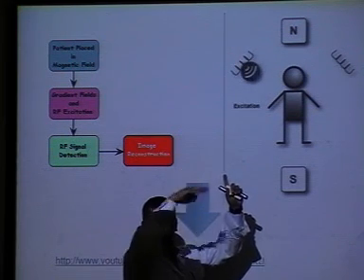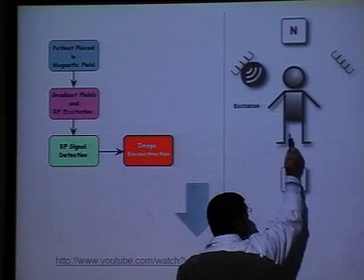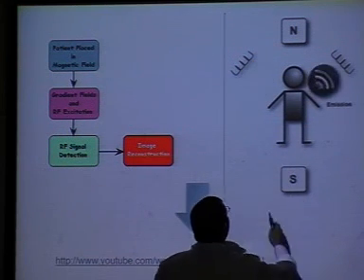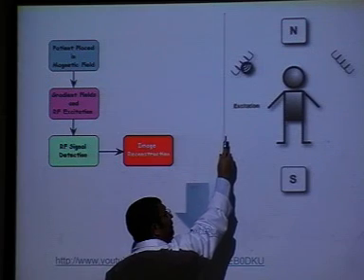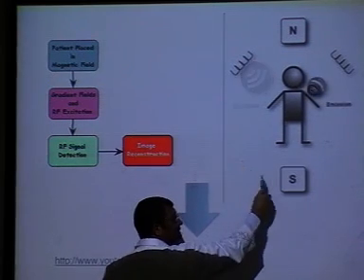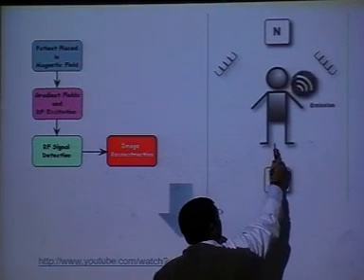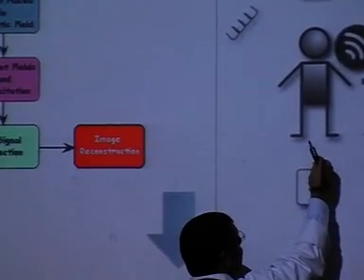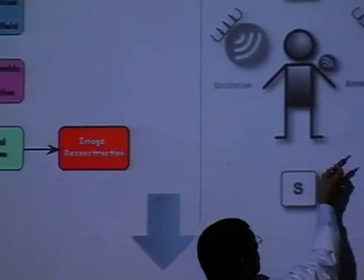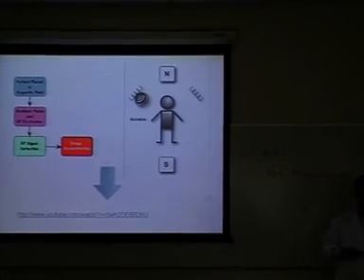They will align or anti-align, and I get the net magnetization along the patient's long axis. If I apply an RF signal whose frequency is the same as the precession frequency, at resonance, it will interact with these and excite the magnetic moments of the protons. As a result, when they go back, I get that given-off electromagnetic energy, which is detected on the other side.